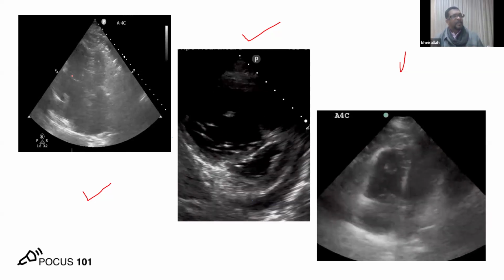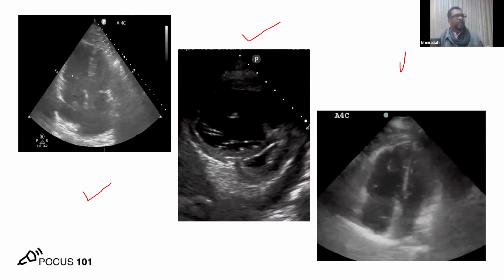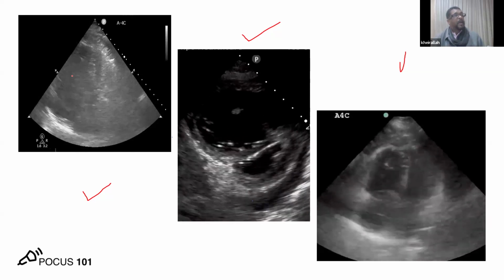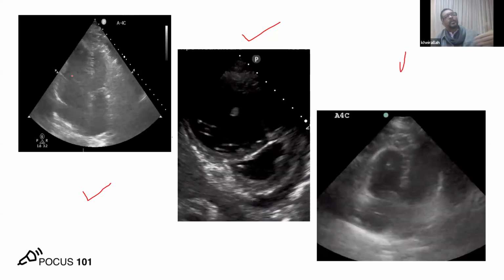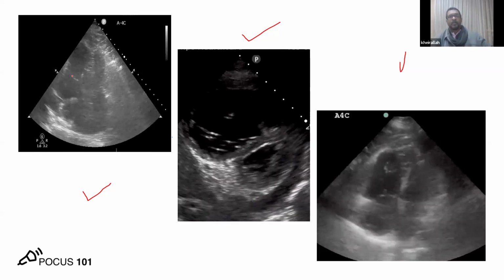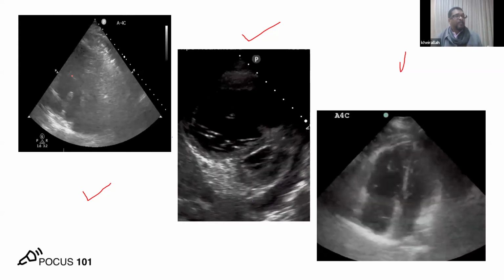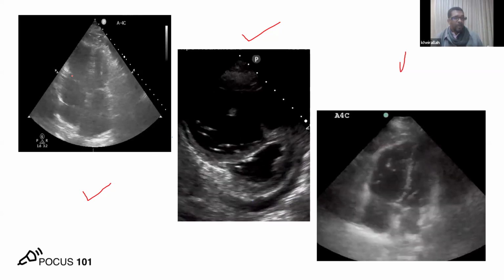Sometimes patients are inherently poorly echogenic. No matter how hard you work on the image quality to improve it, they are always like that. Okay? And in emergency situations, the patient may not even be able to tilt to the left side because of severe chest pain or severe shortness of breath. We have done echoes in a patient semi-sitting, because they cannot lie flat. This comes at the cost of the image quality. So we have to accept.